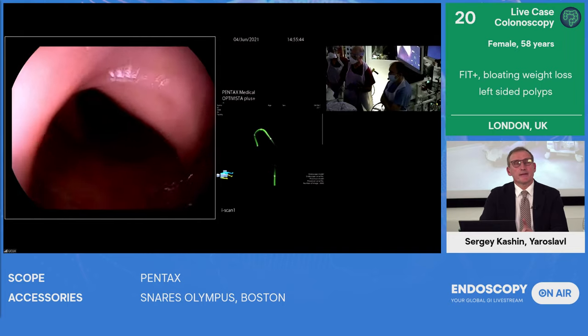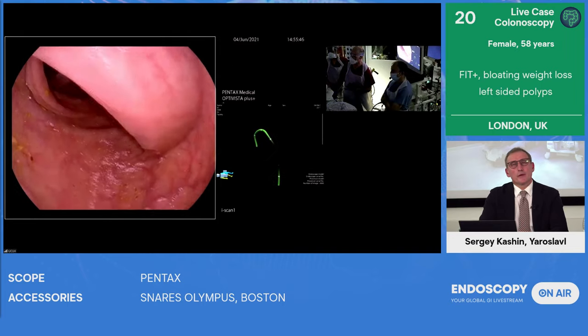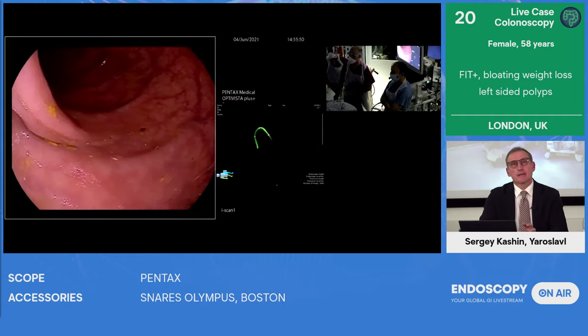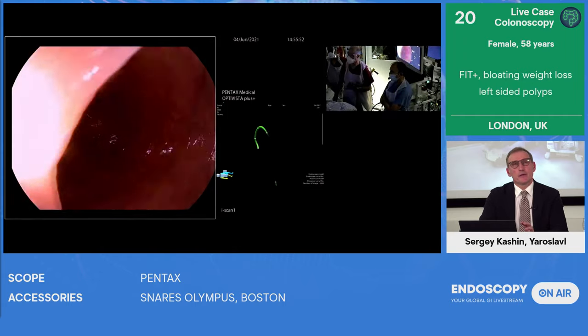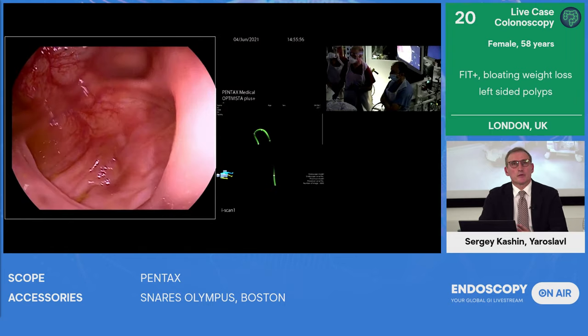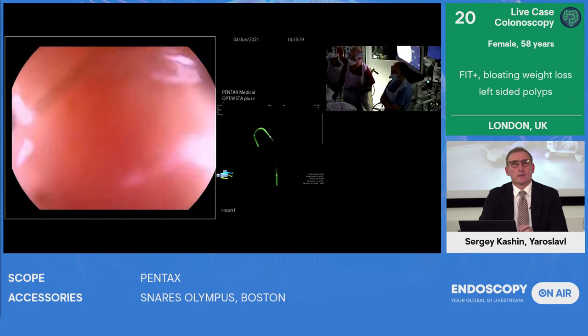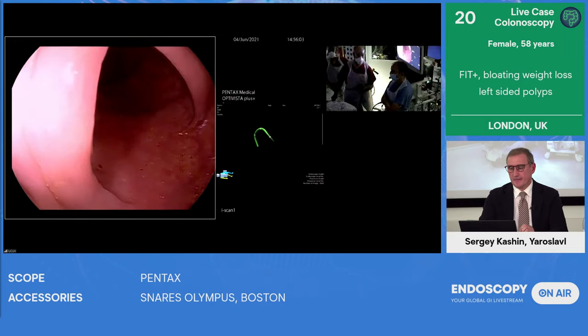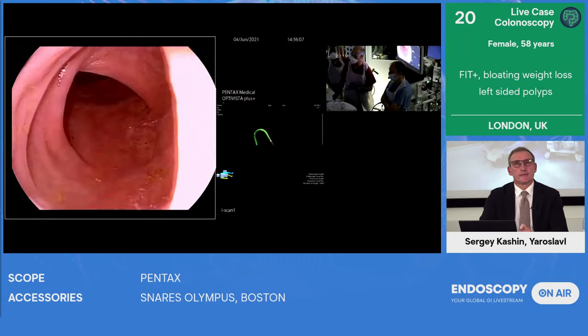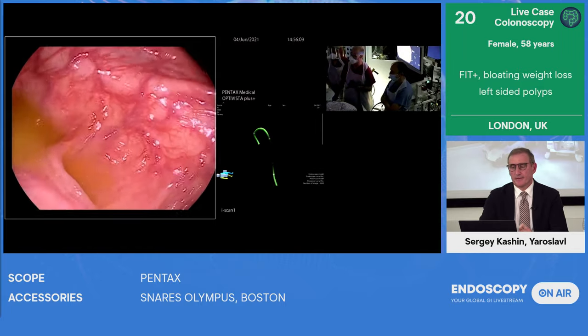Sorry, Brian, Ed, we have to move to Rehan in 5 minutes. Let me ask you about the role of artificial intelligence in colonoscopy. What do you think about discovery? What are your impressions? Well, this is actually the first time I've used it, so I'm thinking it's probably very accurate for picking up polyps.